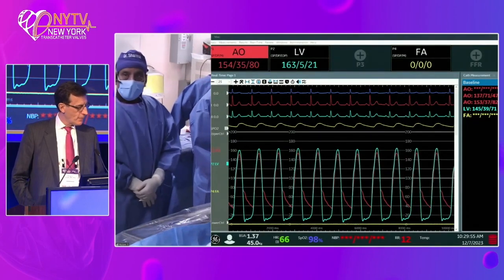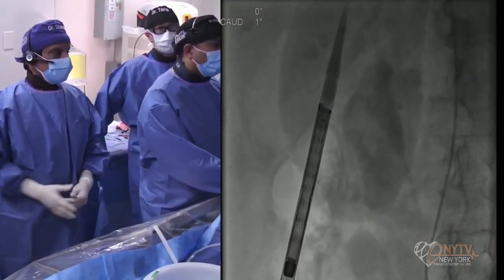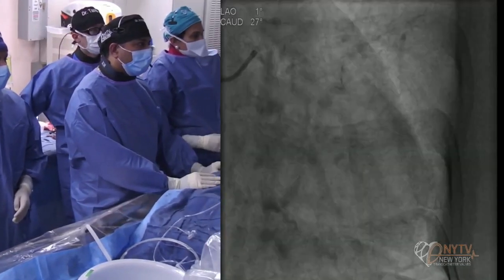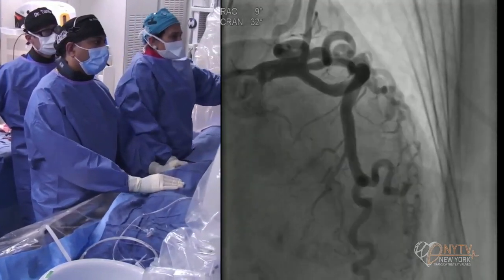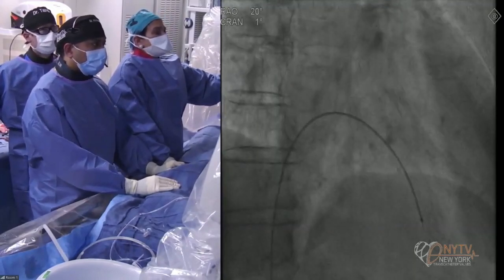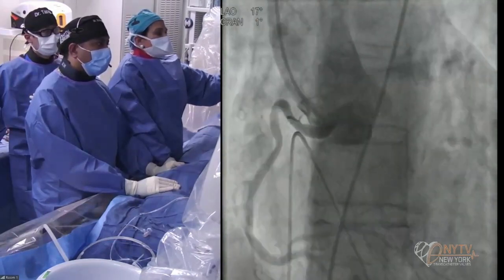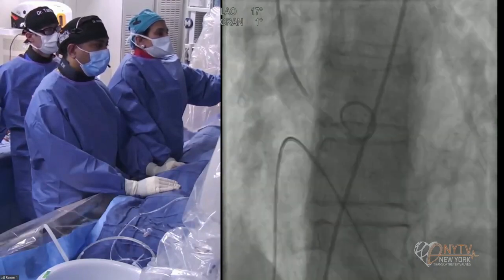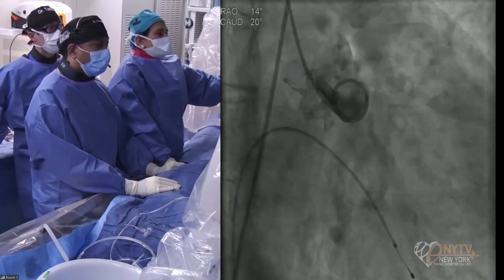Perfect. Go back to the fluoro, please. We'll show you the aortogram, the implant views, and also the arch angiogram, showing why we could not use Sentinel. We did a coronary angiogram today, non-obstructive, almost normal. There's a big fistula. Here's the cusp overlap view. We can actually get a cusp overlap here despite it being quadricuspid.